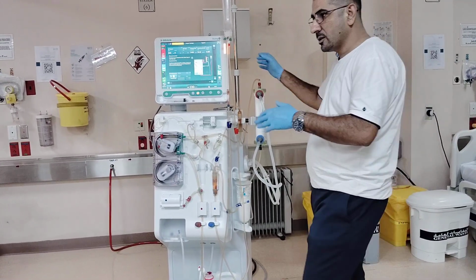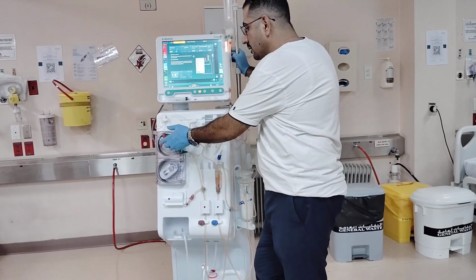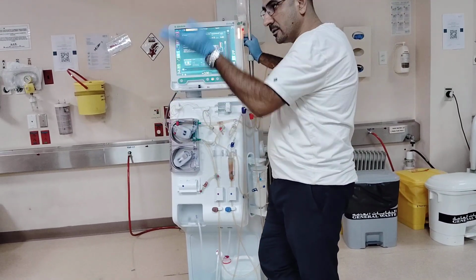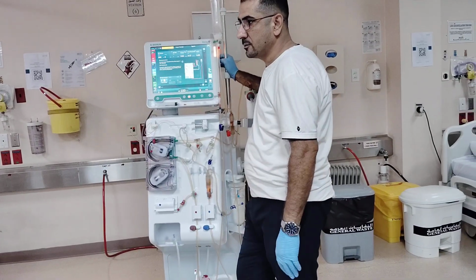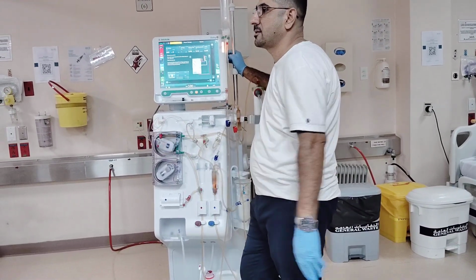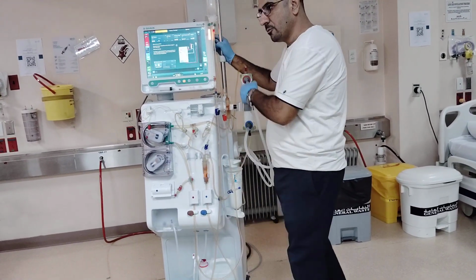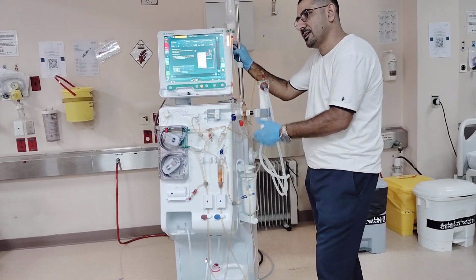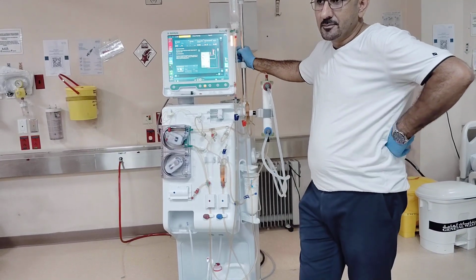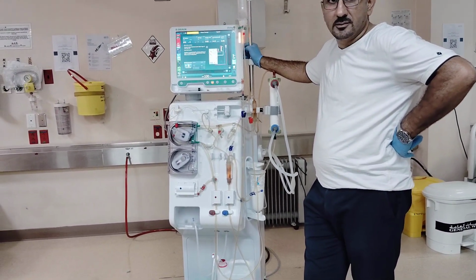And the most important thing, as soon as you disconnect the patient totally, make sure the blood flow reaches up to 300, 400. Because if you keep it too slow, you will get a system fault, because we still have a blood compartment inside, that's why. So from case to case it will be different.